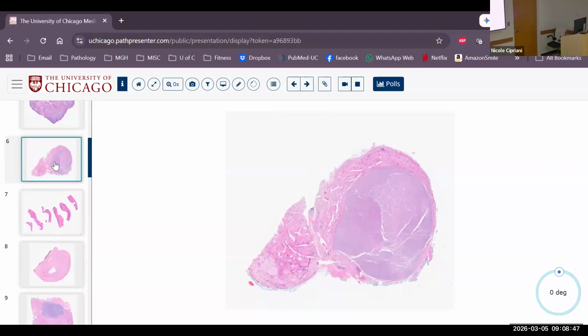You can only say that there's PTEN mutation or PTEN loss in this tissue. Please work up the patient for germline, right? So you can say, with suspicion for PTEN hamartoma syndrome if you want, but I would probably just say multiple adenomatous nodules, but I wouldn't call it follicular nodular disease, right? I would say, see comment. This is not benign follicular nodular disease. This is likely to be PTEN hamartoma syndrome.